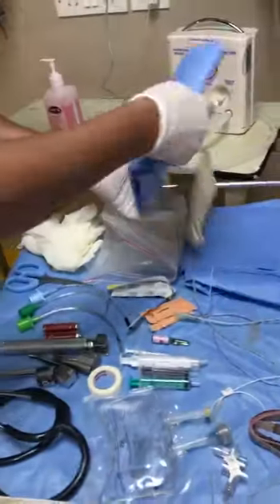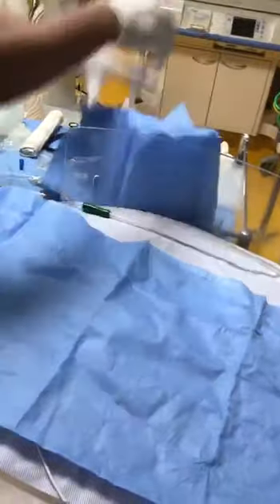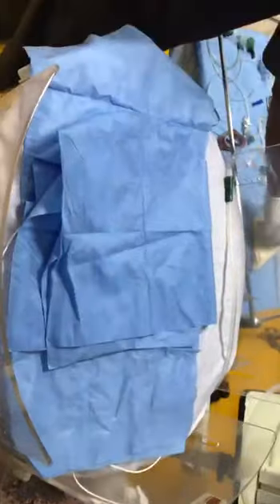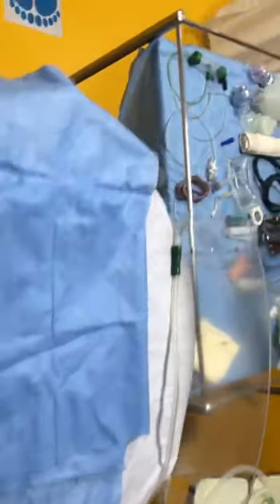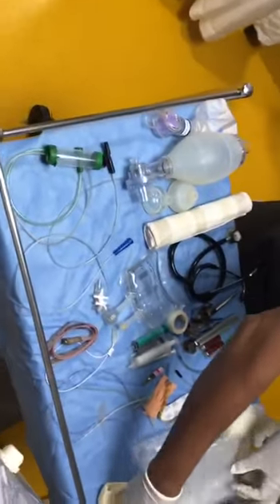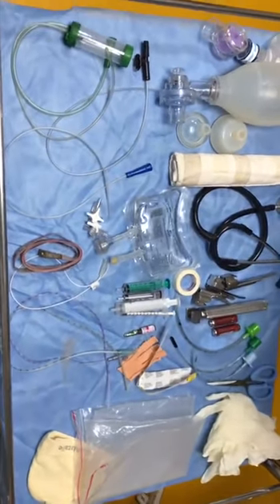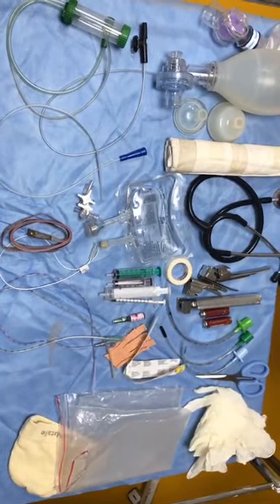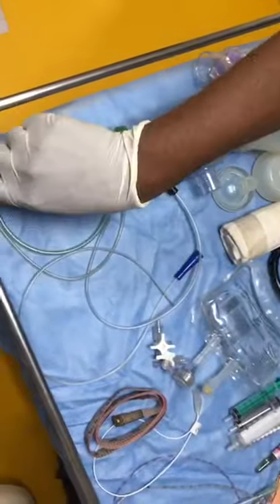And just putting the two linens for receiving the baby. It should get pre-warmed. Okay, let it be here for some time. For maintaining the warmth of the baby, I have a cap here. I have a plastic wrap. If at all the baby is going to be preterm, I may use it. And the clingfilm is there. For clearing the airway, I have a suction apparatus that is already working.